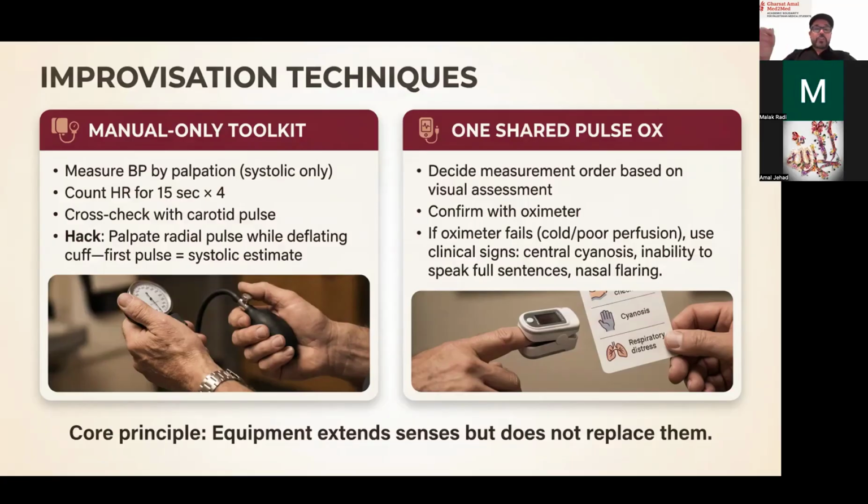If you take the arterial blood gas and measure the oxygen, it'll be normal. How could that be? That's because this is just an estimate. And an estimate only works when the conditions are good. What is the condition in which that's not good? When you have low blood pressure, shock, and that means, unfortunately, the circulation in the fingers is not good, or it's really cold, or the person's hypothermic, temperature is low. Then the oximeter may not be the best. Okay?